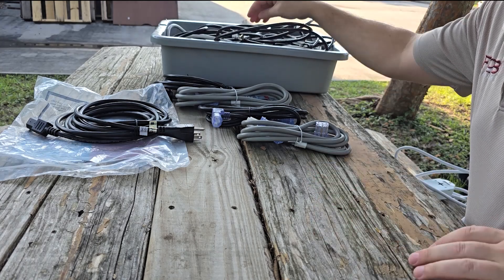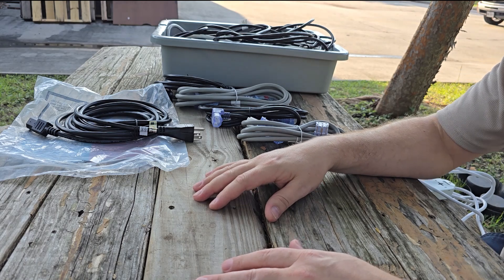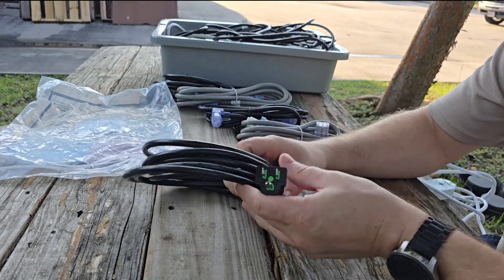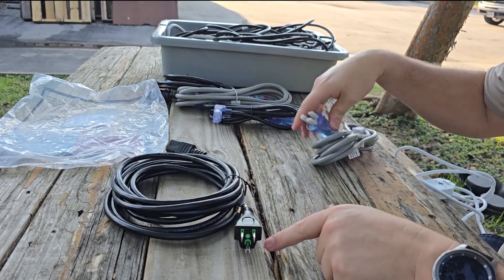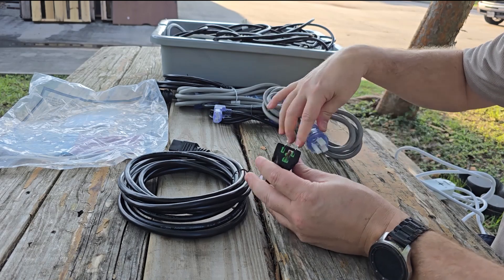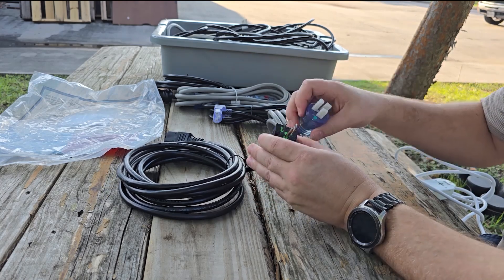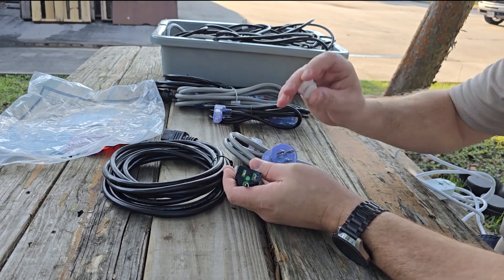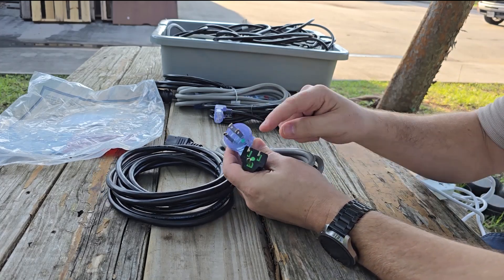We find all sorts of two-prong cables out in the field, and unfortunately they migrate in when consumer-grade devices are intermixed with medical devices. When you're ordering power cords for a medical facility you're going to be ordering medical grade — cords that have a little green dot. This one here is a very interesting cord made by Triplite. It's got a smaller head but is still compliant with medical grade, meaning the outside of the insulator is a certain distance from the metal prongs, and those prongs are solid, not folded over.